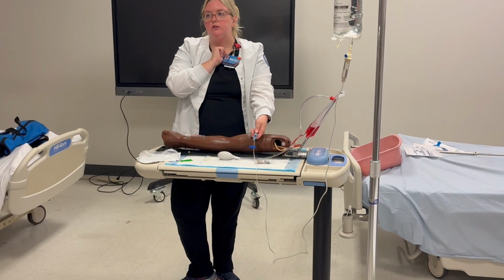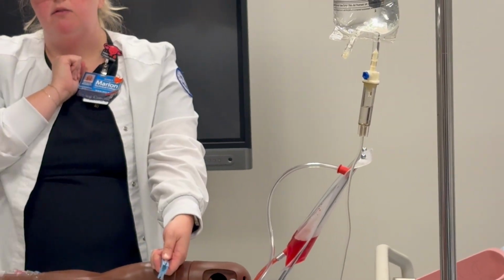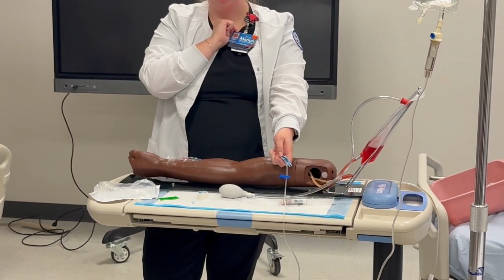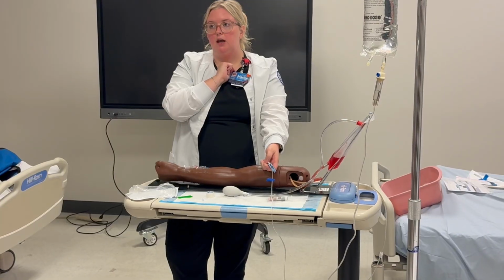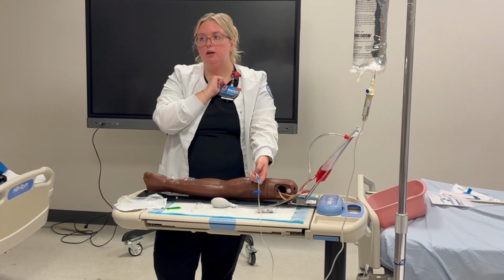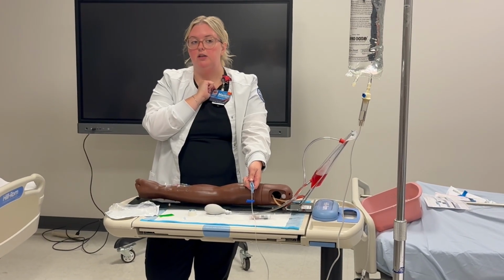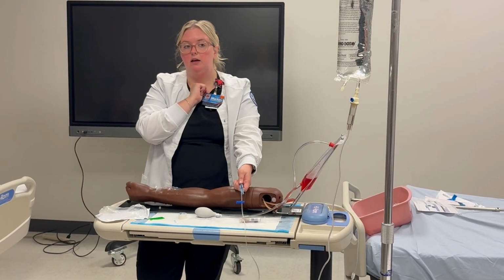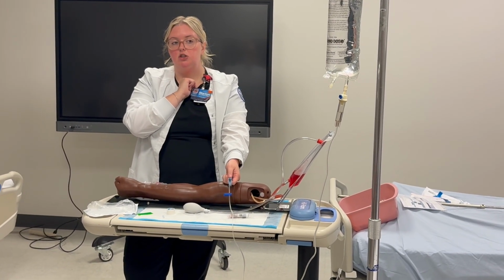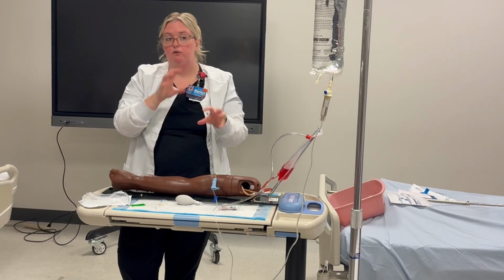So when we get to dosage and we start talking about drops per minute, when you're hanging something by gravity, those are literally the drops you're counting. If this isn't moving, what is the patient getting? Nothing. If you can't see the drips, if that drip chamber is full, you can't see if the medication is infusing or not. I'll show you that with the secondary bag. So in your checkoff, you're gonna say my medication's infusing. Now I'm gonna start my secondary, and you can do your second or your third medication check for your secondary.